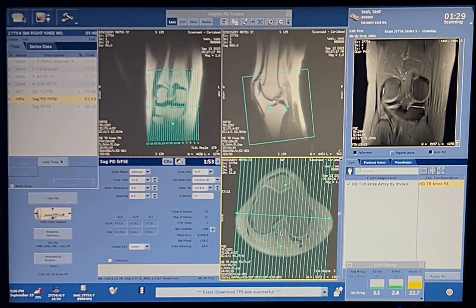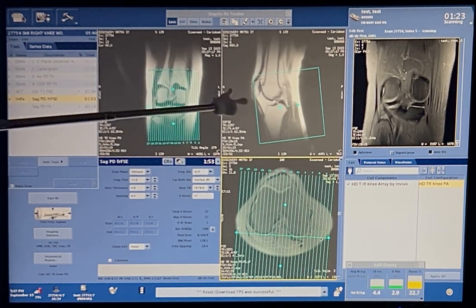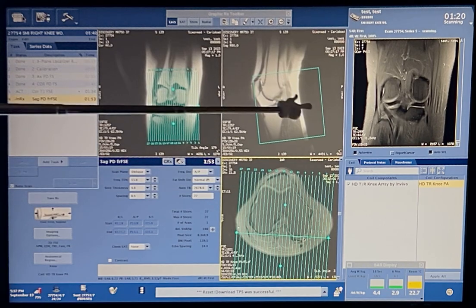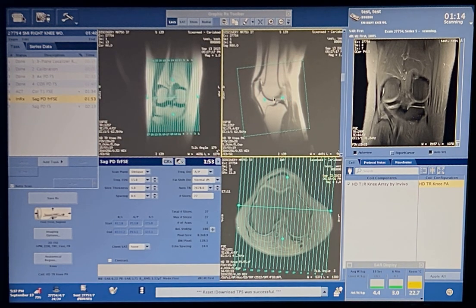I want to move it, but I shouldn't. Yeah, you can move it. Look, we're already off center. See how it went down when you moved it over here? And then when you moved it down over here, it went back. So I should move it back here? Yeah, let's center that. There you go. Very nice.